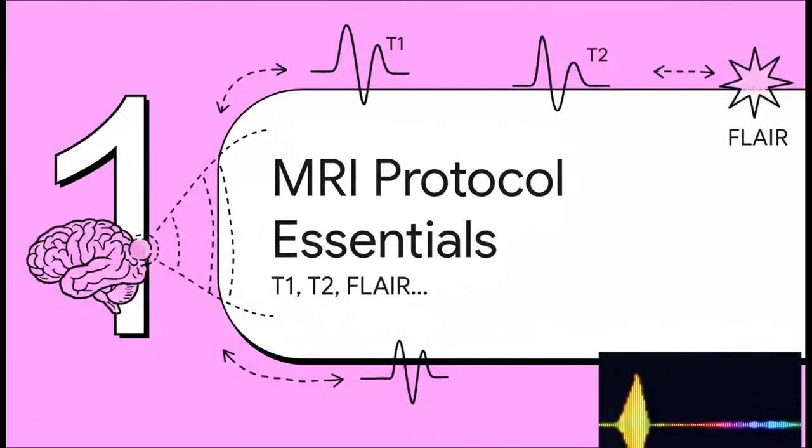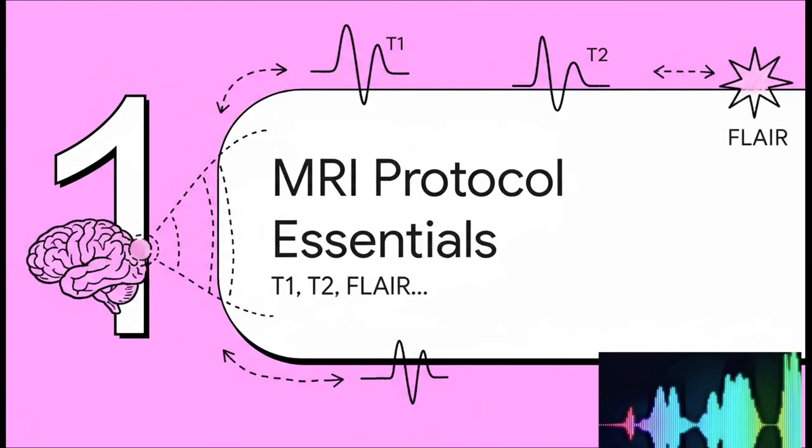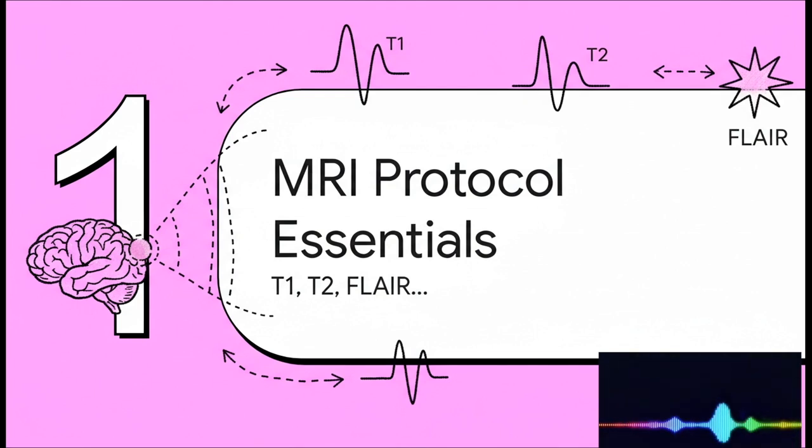All right, first things first, the MRI protocol essentials. We're talking T1, T2, FLAIR. What does it all mean? Look, there's a reason MRI is the gold standard here. It's just unmatched in its ability to pick out those tiny, subtle problems in soft tissue. But having the tool's one thing. Knowing which setting to use and why, that's where the magic happens.